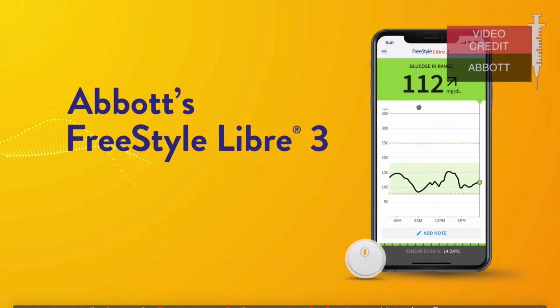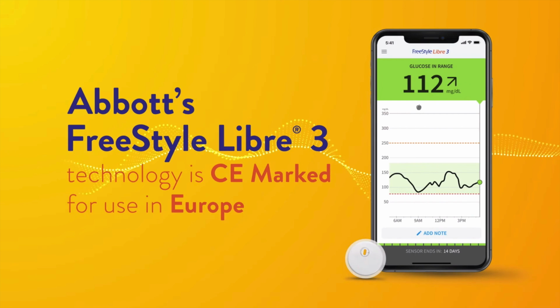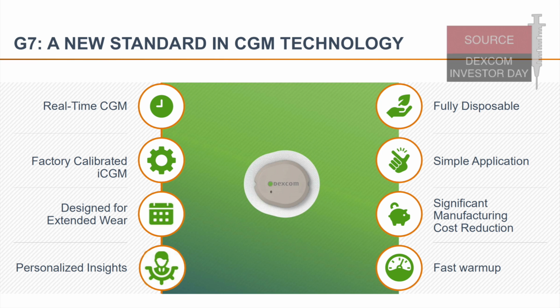As you probably already know, both Dexcom G7 and Libre 3 will be real-time factory calibrated continuous glucose monitors with iCGM level performance. This means that they will both securely transmit your real-time blood glucose data from the sensor to your phone or other digitally connected devices via Bluetooth. In other words, you don't need to remember to check your blood sugar because the data is fed automatically to your device minute by minute.